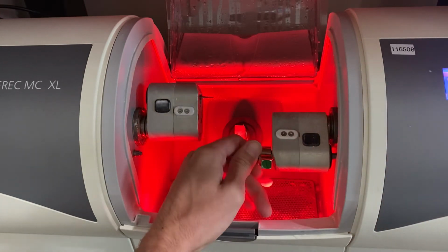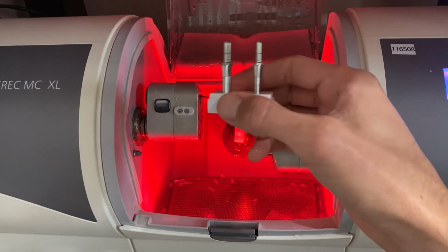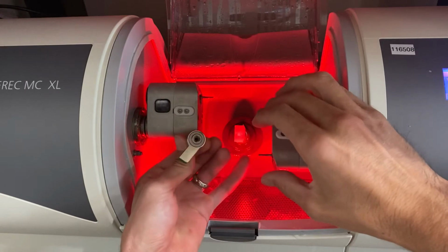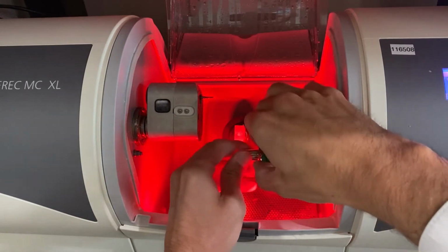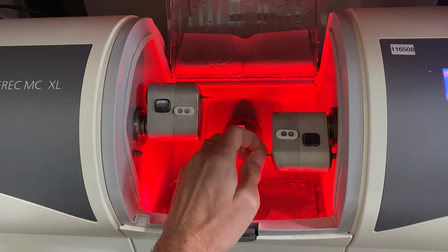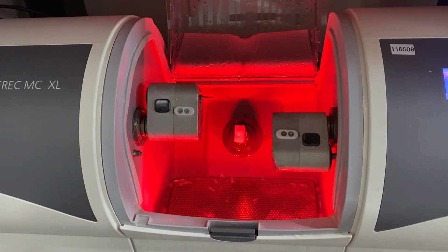Things changed. And so you get your 12S box out and your pointed ones. They look pointed. Your instrument tool here, it's got a little triangle on the inside. Slide it over and then you're gonna hold it in, turn it counterclockwise. Once it gets loose, it'll just turn out.